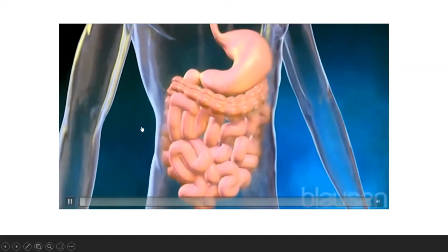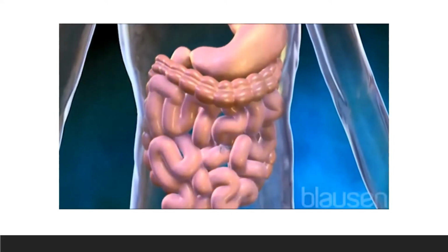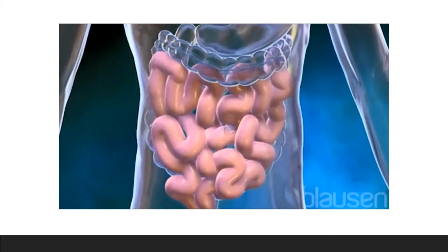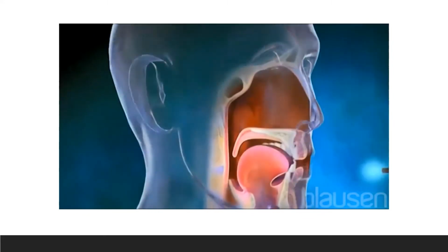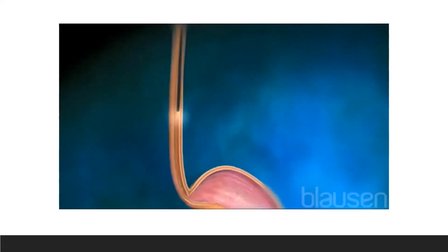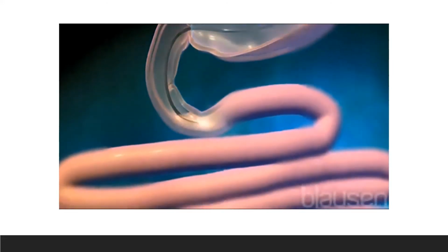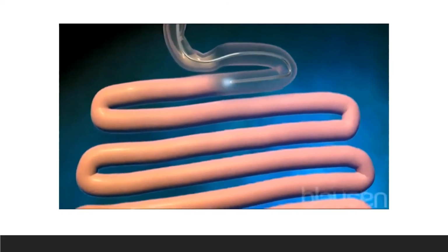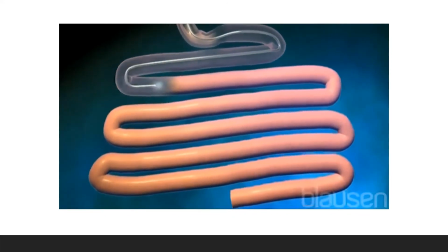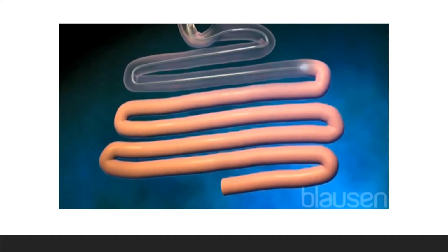Now we have a video for better understanding. Let's watch. The small intestine is part of the gastrointestinal tract, the GI tract. It is approximately 20 feet long and is the site where most digestion takes place. A standard endoscope may be used to examine abnormalities of the small intestine, such as tumors and bleeding. However, these endoscopes may only reach the first 3 to 6 feet of the bowel. Oftentimes, the abnormality is located in the remaining small bowel.